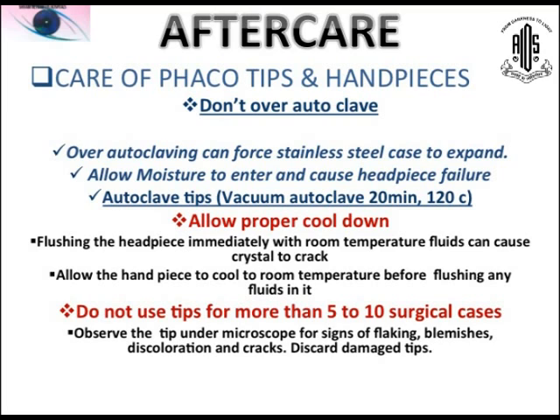Do not use a tip for more than 5 to 10 surgical cases. Observe the tip under the microscope for signs of flaking, blemishes, discoloration and cracks. Discard damaged tips. Though I must humbly accept I have used tips maybe 50 times and have not found any problem, after checking the tips I always find out whether I need to change the tip or not.